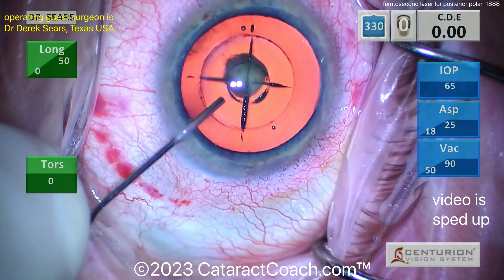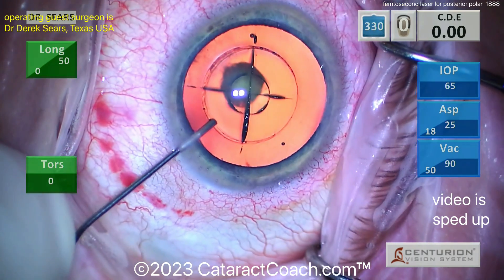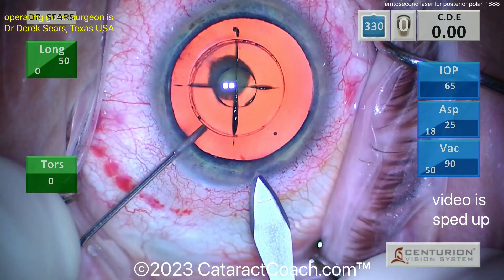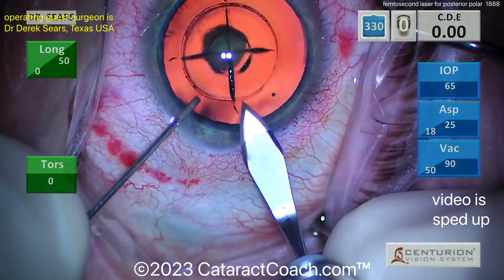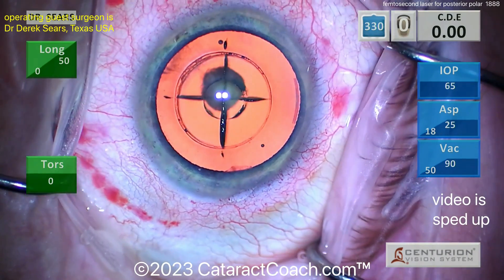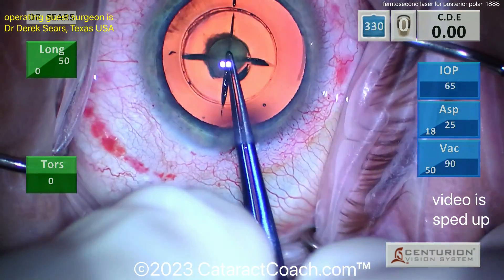Notably, the laser was not used to soften the nucleus because that would put a lot more energy in the eye and create a lot more bubbles or air in the eye. Here comes the main incision — notice that this surgeon, even with a femtosecond laser being used, prefers to use a proper blade. I like a diamond to make that incision.